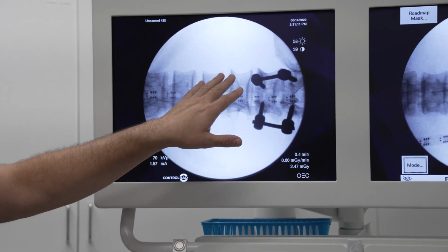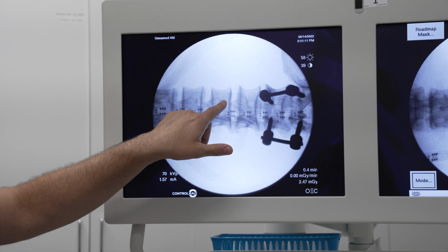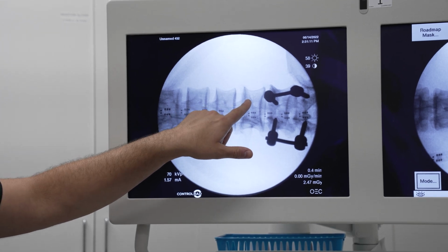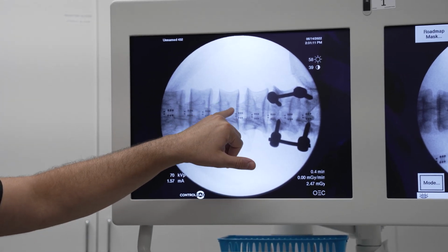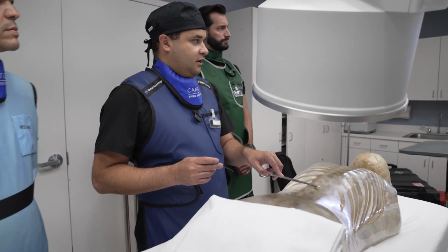So we're going to show both of these from this procedure, from this setup right here. So first I'm going to do a transforaminal, then I'll do a medial branch block here. We're going to go in this view, then we'll go lateral, and then you guys will try it, okay? So we want to be right on beam when we start.